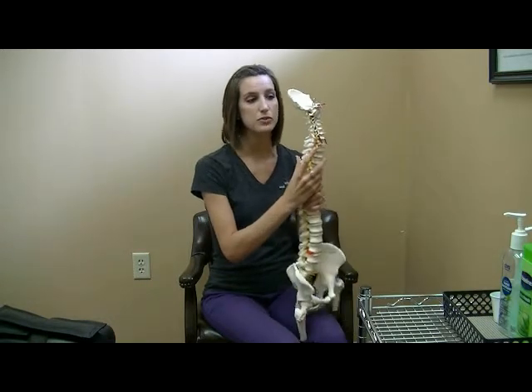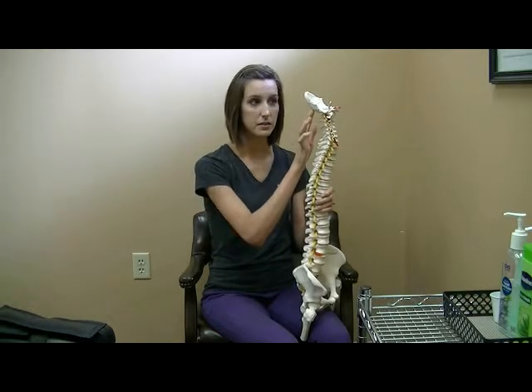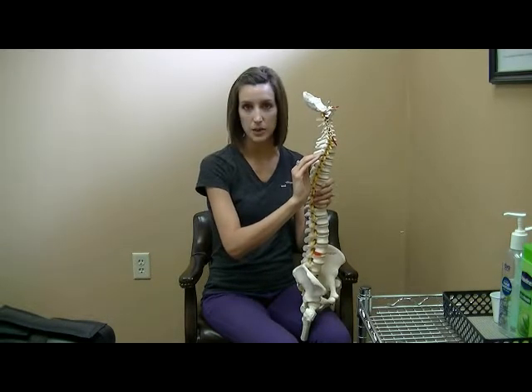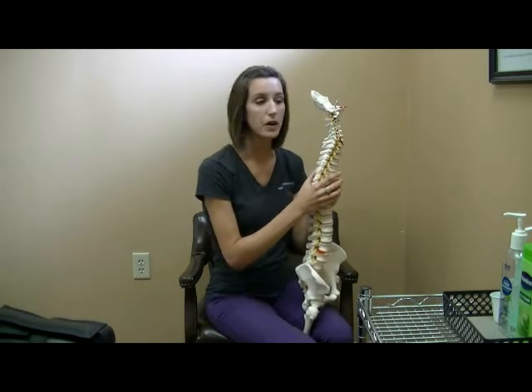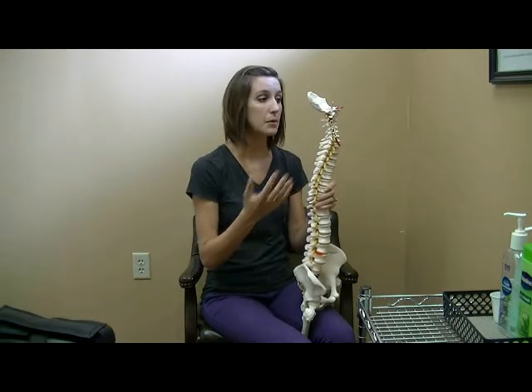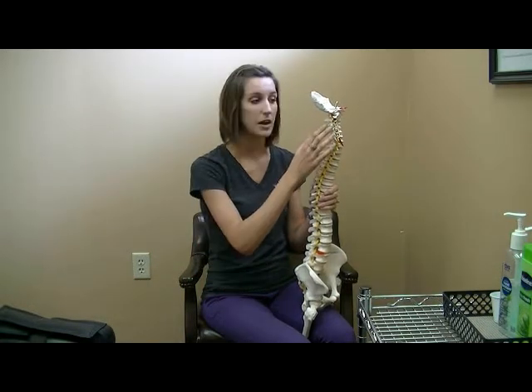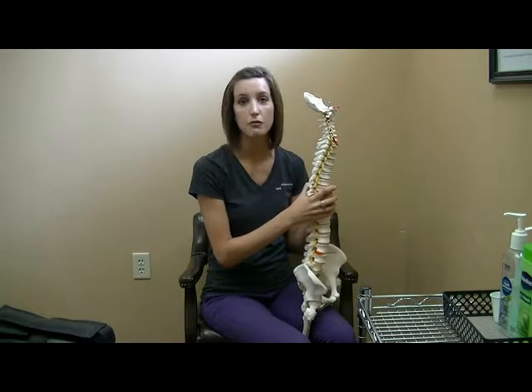From a side view is usually where I get most of my information. So from a side view, this is the back of the head right here. You should have curve in the spine. You should have a forward C curve in the neck, and then the opposite way through that upper back. So from a side view, we very often see that people have lost that curve in their neck. And that can be because of a whiplash or a trauma or an injury in the past. Even if a car accident was 20, 30 years ago, it can affect how this is going to look down the road. But it's also more commonly from posture.